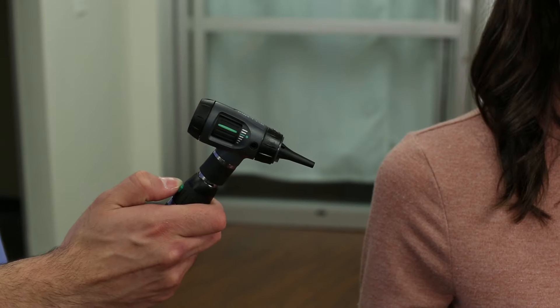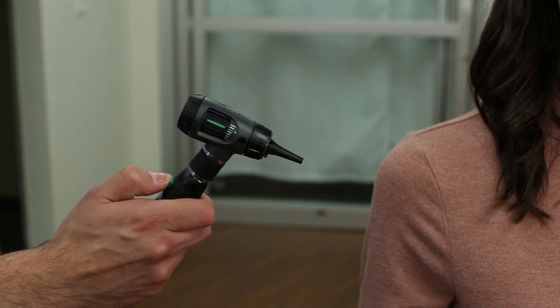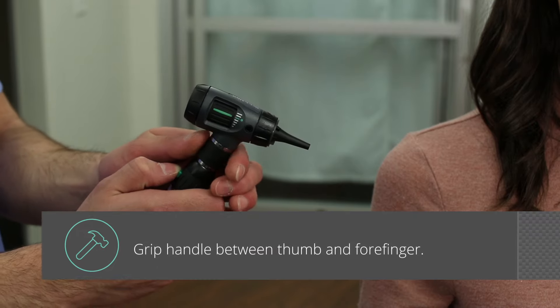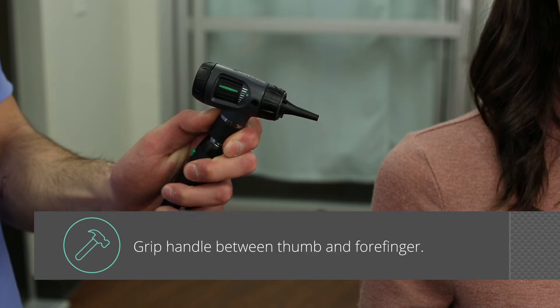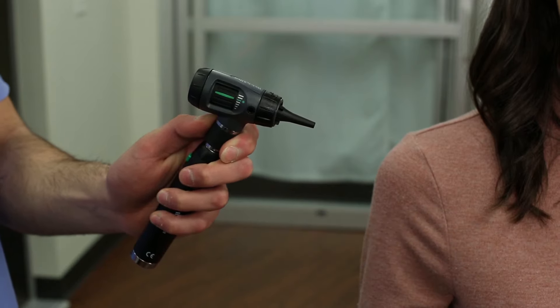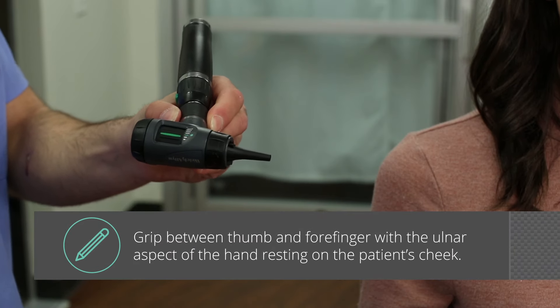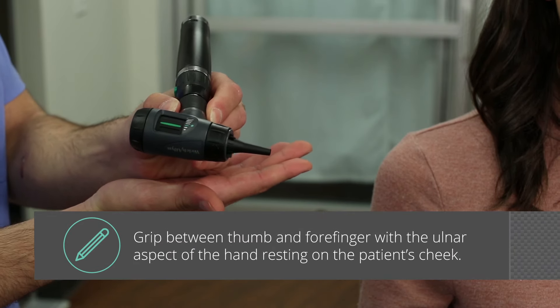There are two common ways to hold an otoscope and it's all a matter of preference. Some clinicians choose to hold the otoscope like a hammer, gripping the power handle between the thumb and forefinger close to the light source. For more control, some clinicians choose to hold the otoscope like a pencil between the thumb and the forefinger, with the ulnar aspect of the hand resting firmly but gently against the patient's cheek.